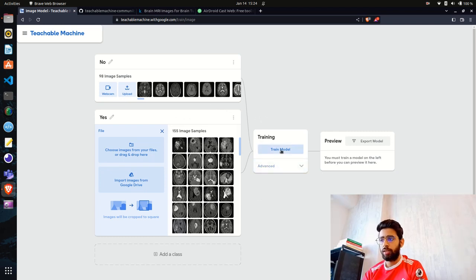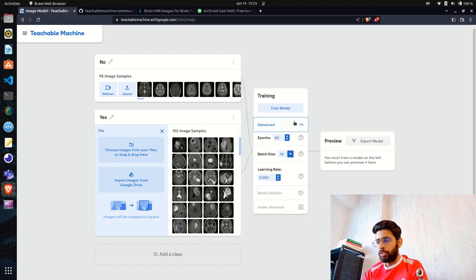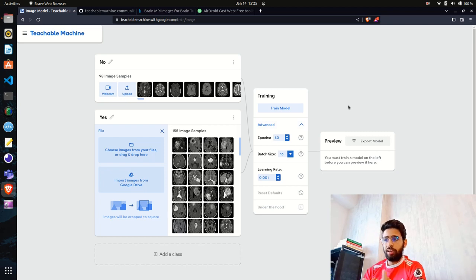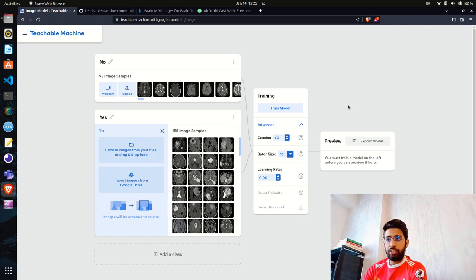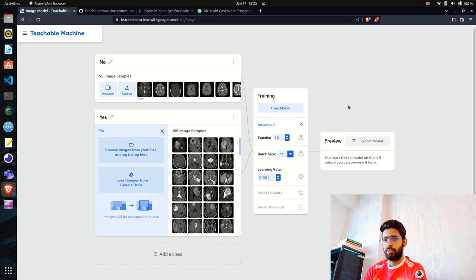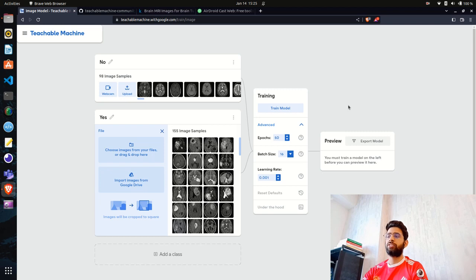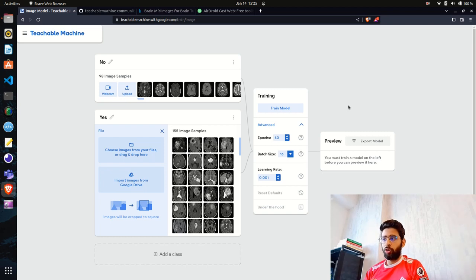Once uploaded, we have the option to 'Train Model.' In the Advanced settings you can see parameters like epochs, batch size, and learning rate. I'm assuming you don't have a deep learning background, so I'll skip these. This platform is mainly for non-tech users — people who want to classify things like breast cancer, brain tumors, or COVID from X-rays and CT scans without writing code.